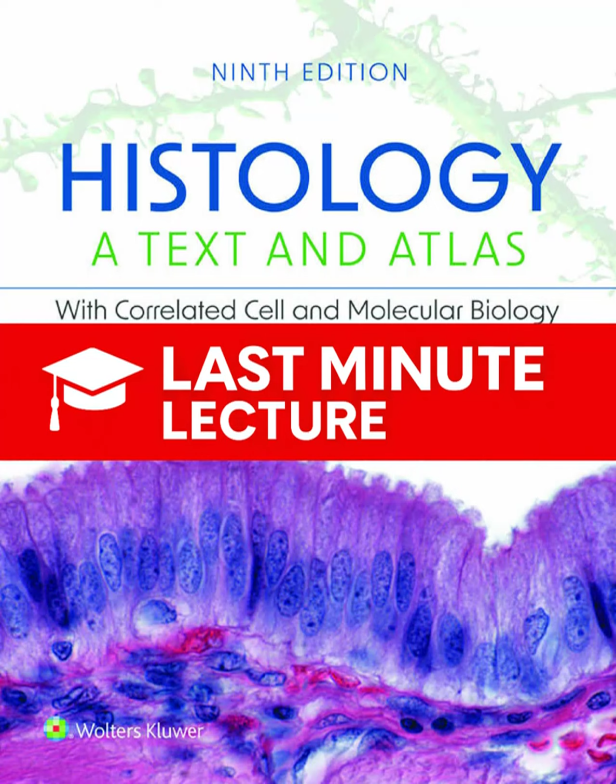Okay, let's wrap up with virtual microscopy, or VM, which is transforming how histology is taught and practiced. VM just integrates the conventional light microscope with high-resolution digital technology. Instead of looking through an eyepiece, entire glass slides are scanned at high magnification to create huge 2D digital files, the virtual slides. For a learner, this is a massive leap in accessibility.